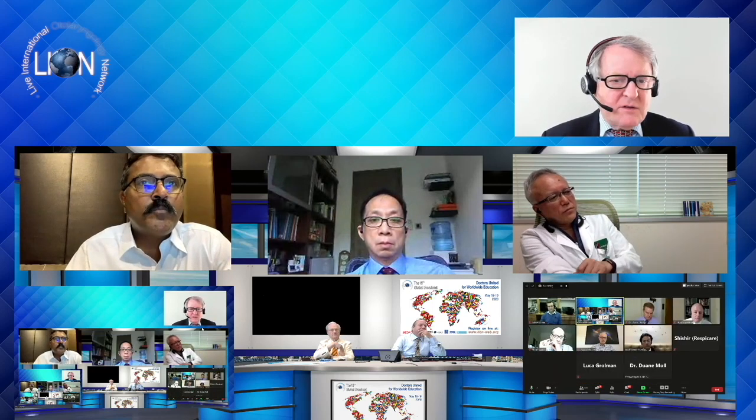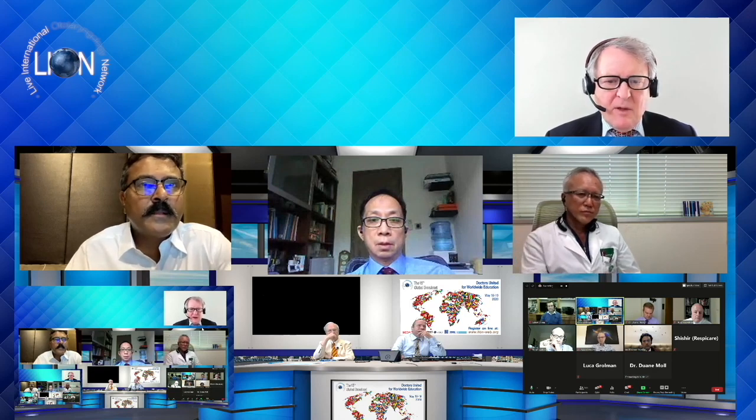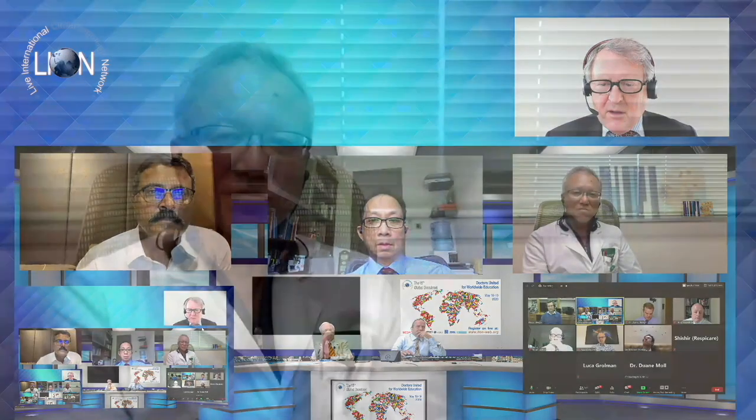Yeah. This is a great trick that you're mentioning here, putting a strong hook into the chorda canal. I know Robert favours that, and I do, and Chris does it as well. What's the situation in Japan? What do you do with the chorda? If it's just falling across you all the time, I suppose if you're doing it endoscopically, maybe it's not so much of a problem.